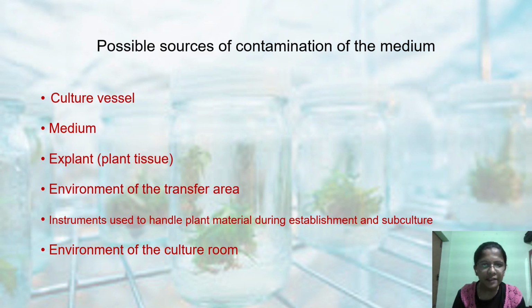And whenever we are selecting the explant also, it should always be selected in a contamination free zone. Suppose it is not sterilized before usage, again it leads to contamination. And also whenever we are transferring that particular explant after selection to the media, at that time also we can experience the problem of contamination.